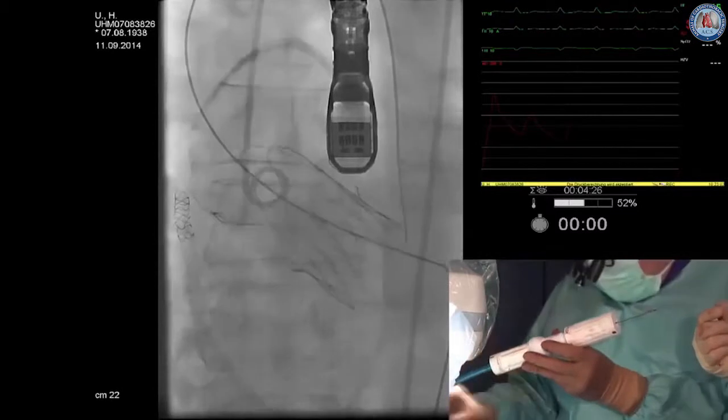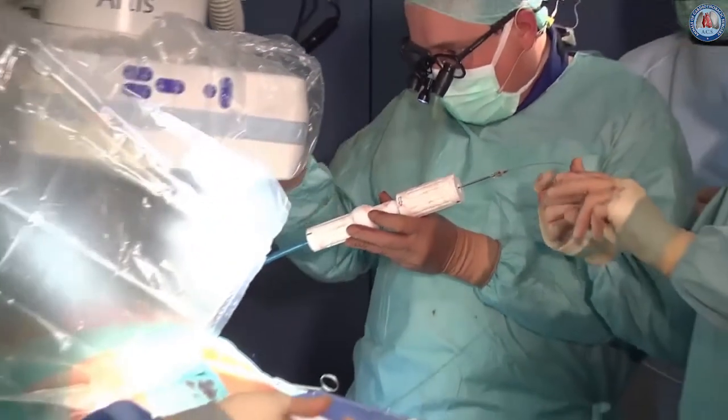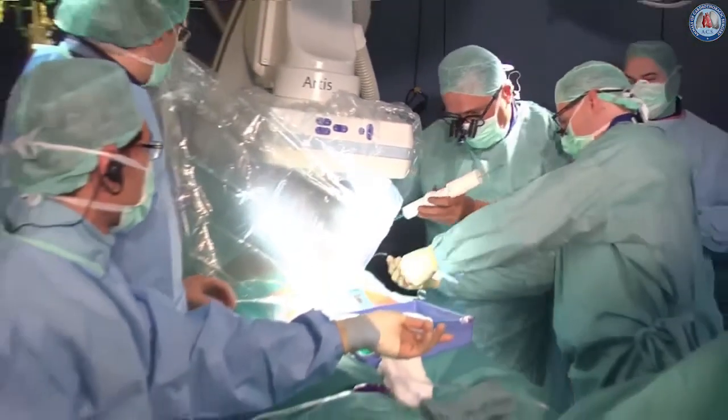Yeah, looks not bad. So now I have to pull out the delivery system first.